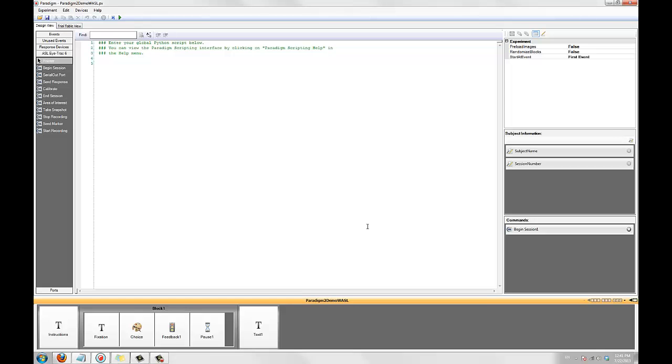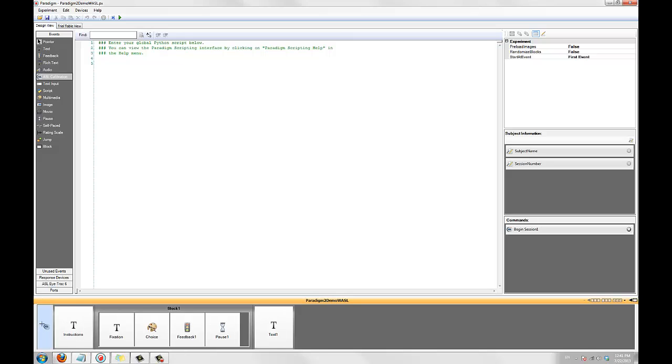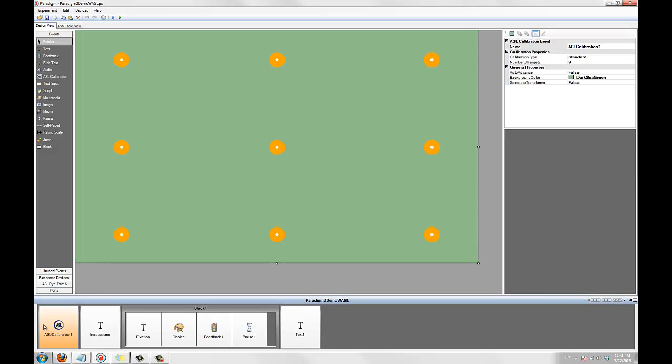Now that we have our experiment communicating with our ASL system, let's add a calibration event to the beginning of the experiment. Paradigm's ASL calibration event can present a 2, 5, or 9 point calibration sequence, as well as infant calibrations that use images or movies as calibration points.